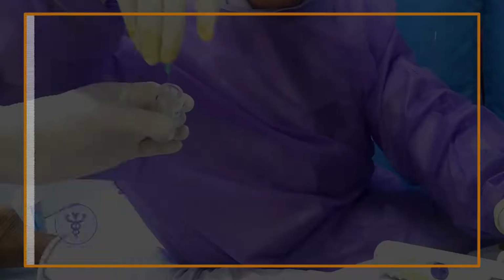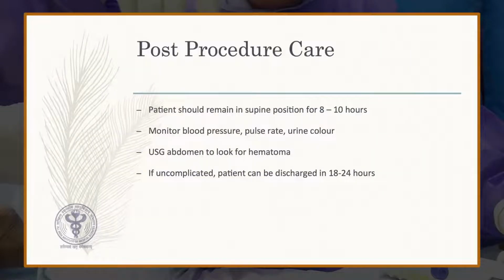Post-biopsy care. The patient should remain in supine position for around 8 to 10 hours. Monitor blood pressure, pulse rate and urine color. Perform ultrasound abdomen to look for hematoma. If uncomplicated, the patient can be discharged in 18 to 24 hours post-biopsy.